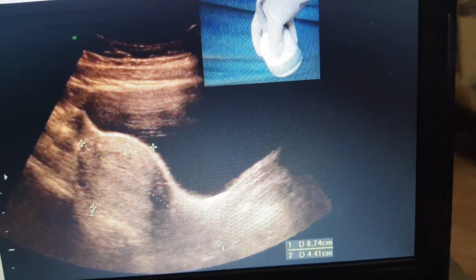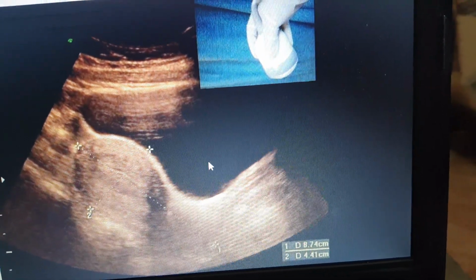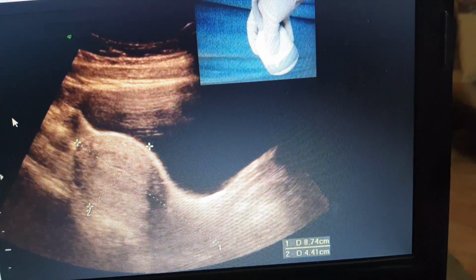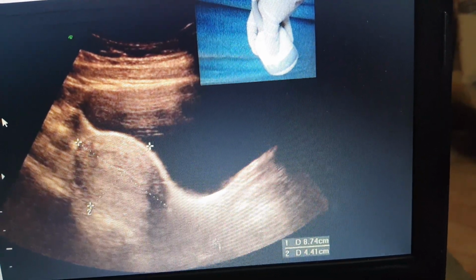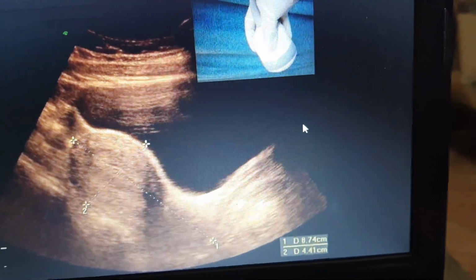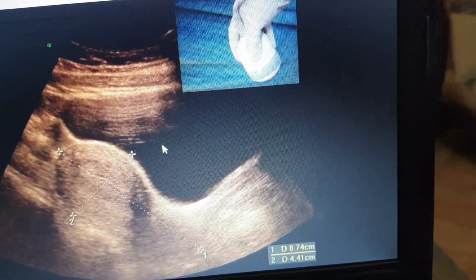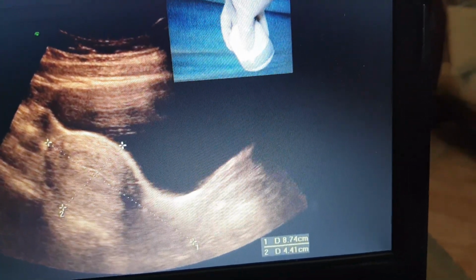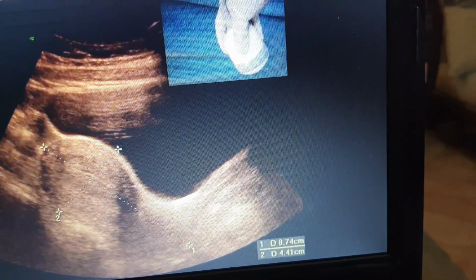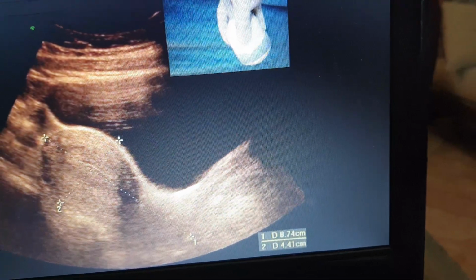and accordingly you should understand properly that when I'm giving you, for example, a longitudinal section of the uterus, it goes without saying that you know that the head of the patient is towards the left side, and her legs or the cervix is towards the right side. That's the very easy picture, and if you understand this picture properly, then if you are going to work in obstetrics or to depict a case of pregnancy, that would be understood properly.